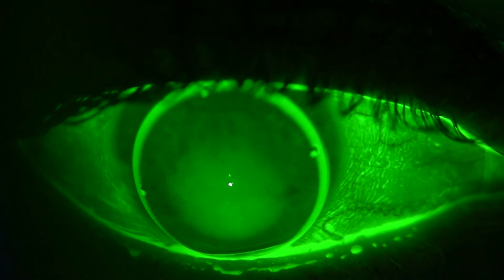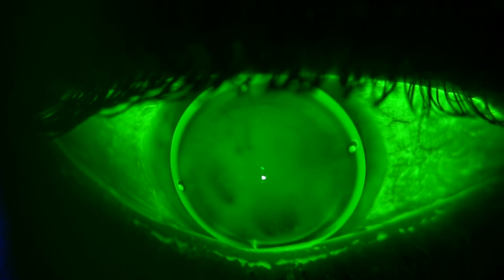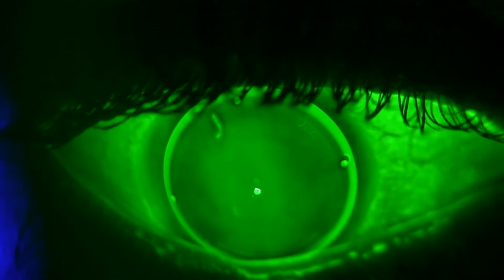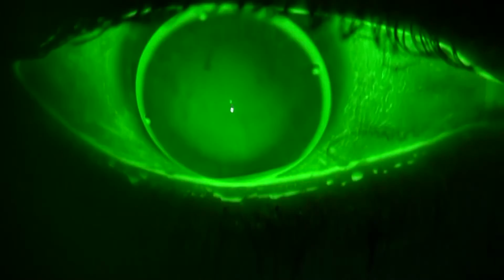When you're evaluating the lens on the eye with fluorescein and your Wratten filter, you should look for a few things. First, you want the base curve to be aligned to the cornea or even just a little bit steep. You want the lens to move just a little bit with blink, and in primary gaze, the lens should rest on the lower lid with the pupil above that imaginary line that we drew at the geometric center. Don't forget to check lens translation.